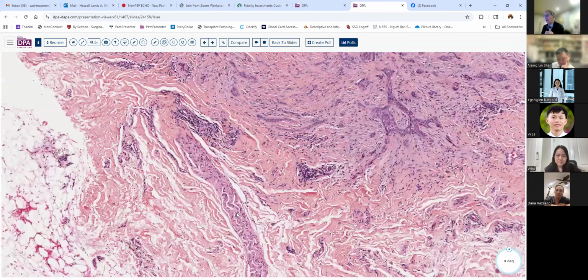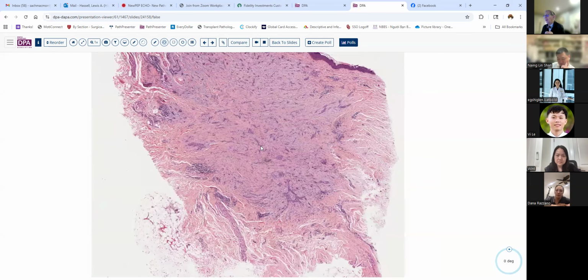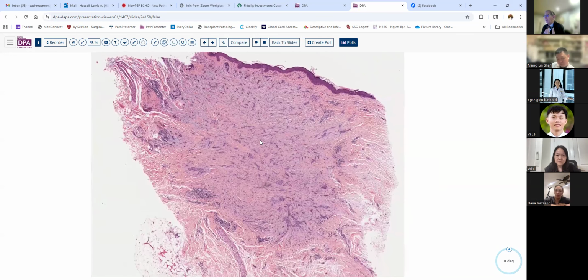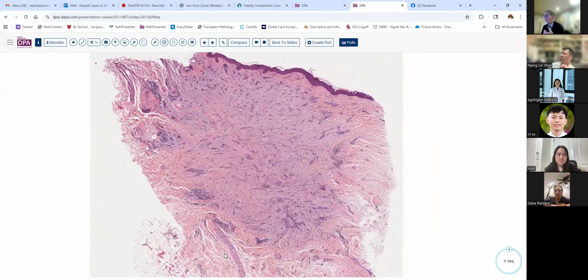It is one of those melanomas that we talk about which are oftentimes not positive for conventional melanoma markers, the HMB45s or the MART1s, but will be positive with SOX10 and S100 usually. This lesion would not be positive with S100, but would it stain positively with pancytokeratins and some of the other markers that can be used for basal cell carcinoma.